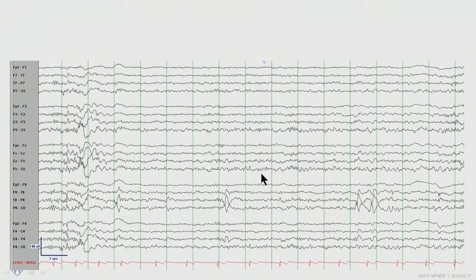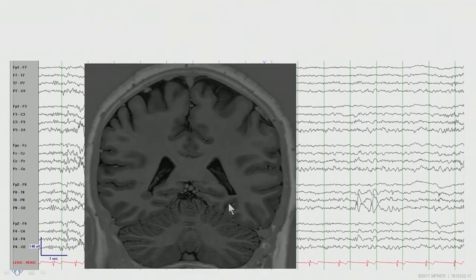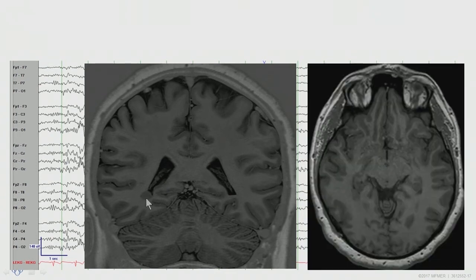This is a posterior temporal discharge seen in a patient with periventricular heterotopia in the right hemisphere, seen in this coronal T1-weighted image. This is actually the heterotopia — you can appreciate it in the axial image as well.